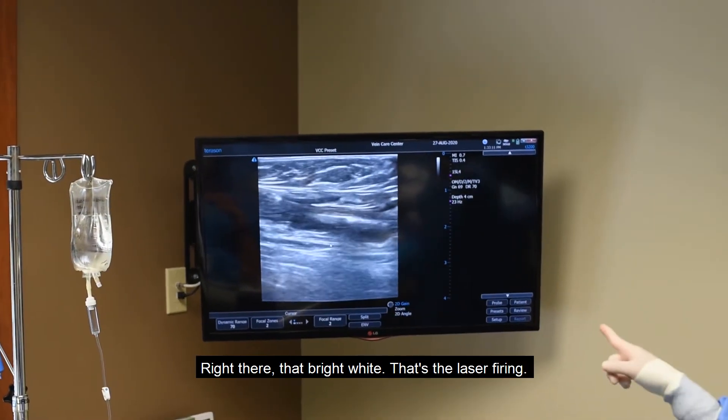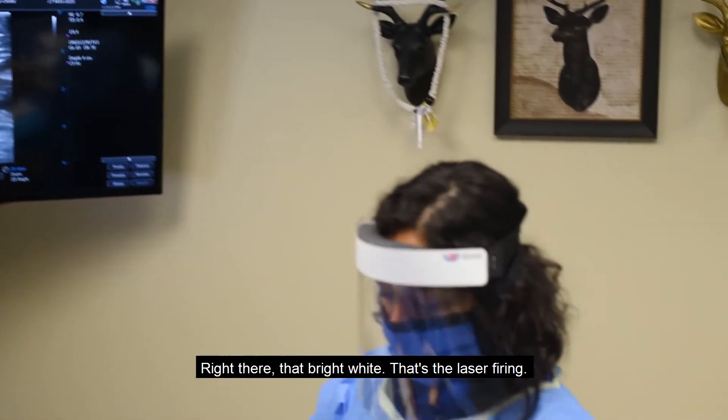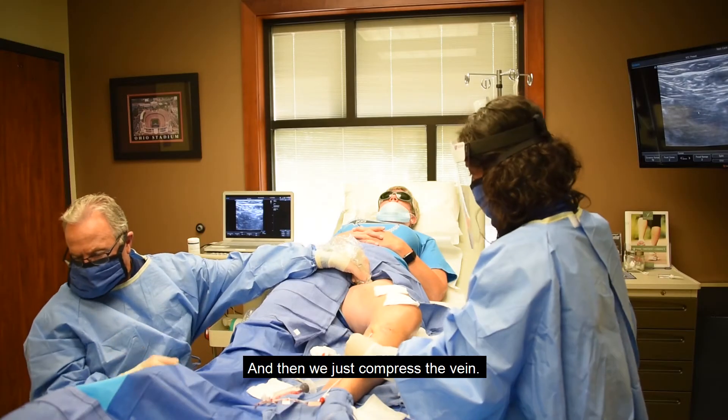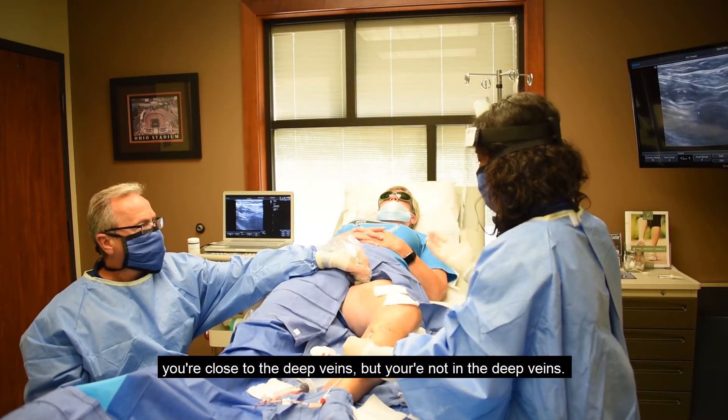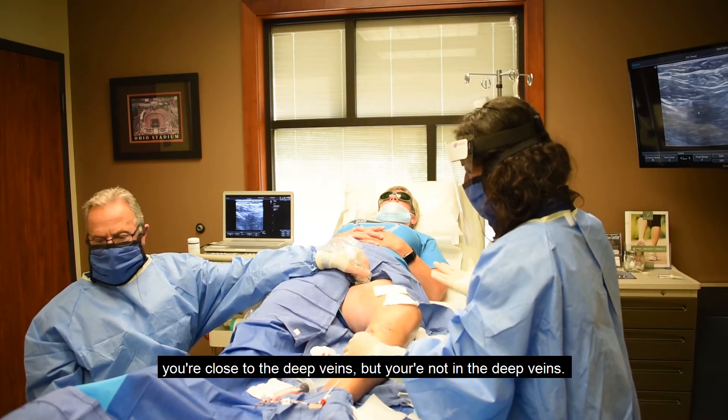That bright white on the screen is the laser firing, and then we just compress the vein at the very top. You're close to the deep veins but not in them, so you want to make sure you're in a safe location away from the deep veins.